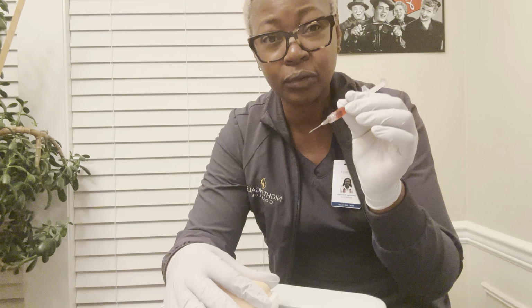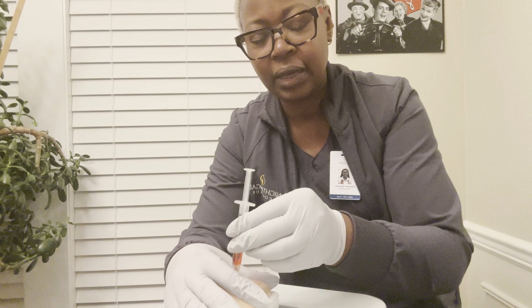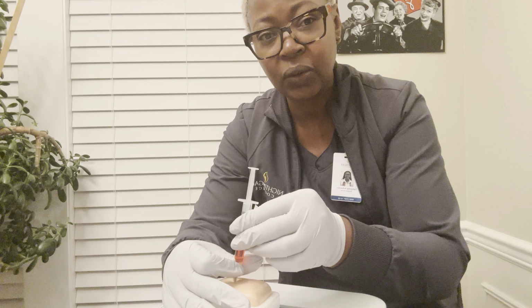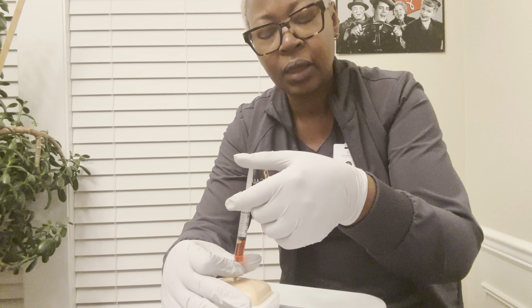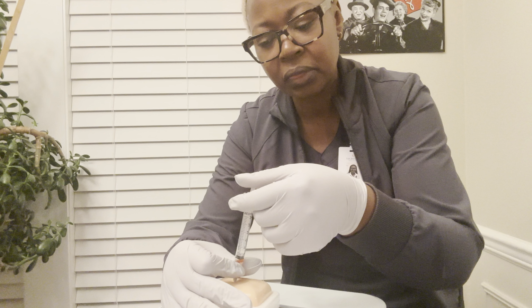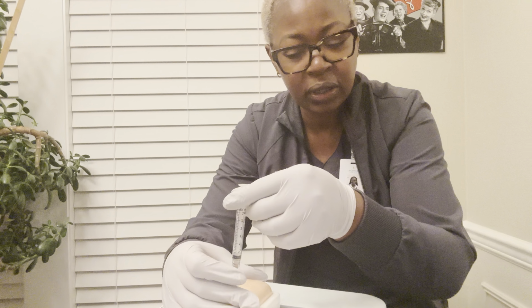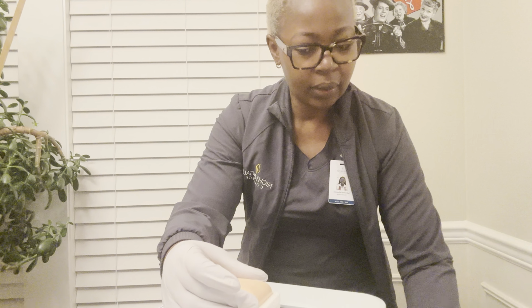At a 90 degree angle, I will inject. And then I will use my 2 fingers to secure the syringe, and I'll use my dominant hand to inject the medication, 1 ml per 10 seconds. So I'll do it like that. I will not cap the needle. I'll put it in the sharps.